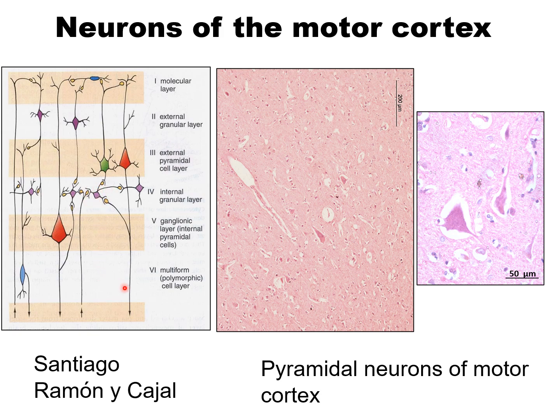This is the hematoxylin eosin stained picture of the motor cortex, where one can identify the pyramidal neurons in a lower magnification. So these are the pyramidal neurons. Apical dendrites have not been stained. The basal dendrites can be seen.